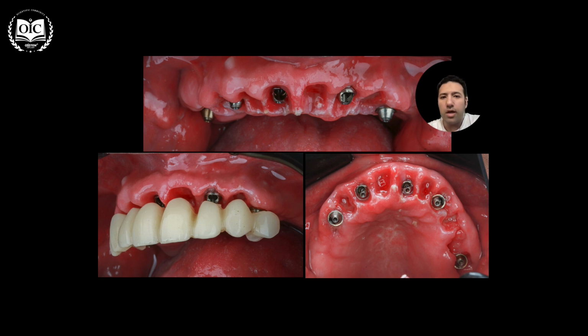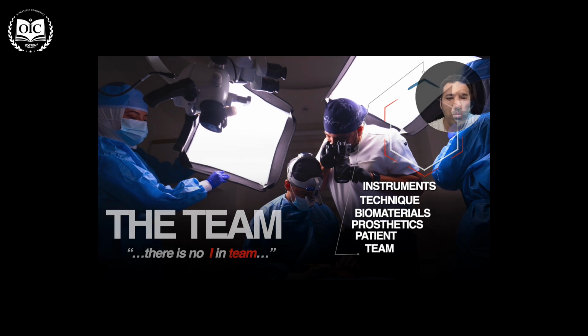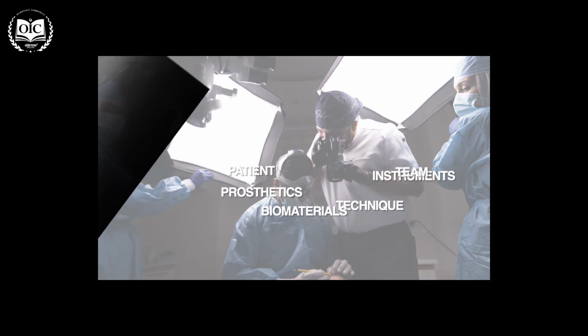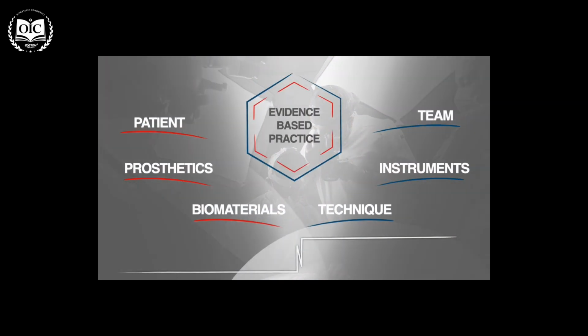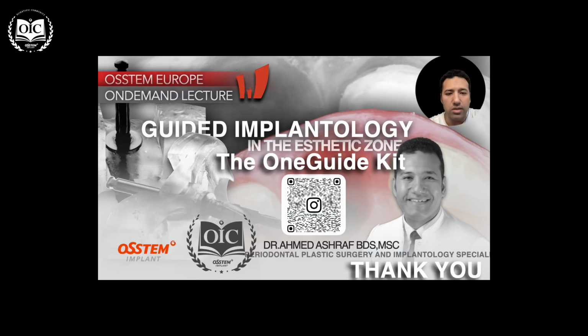Sometimes, if you have the ability to design and mill this restoration in only 1 day, the patient can come in the morning, do the surgery, and go home at the end of the day with the restoration. The patient experience will be really impressive, and this will give you very good patient satisfaction and follow-up. I always remind myself and remind you to work in a team as much as possible, and to select the best biomaterials, the best patients, and the best prosthetic options, in addition to training with guided workflows.